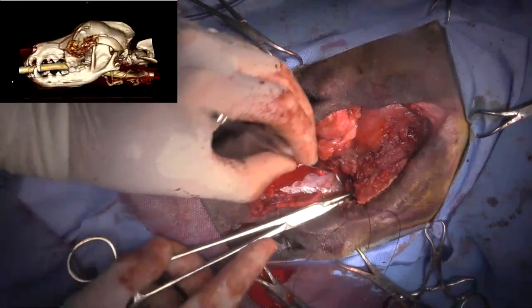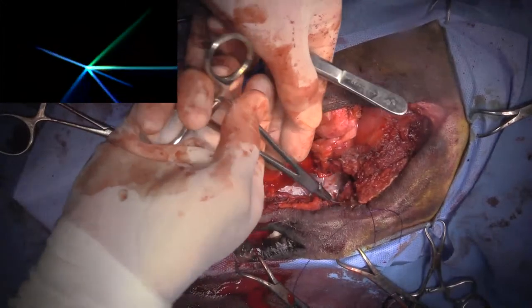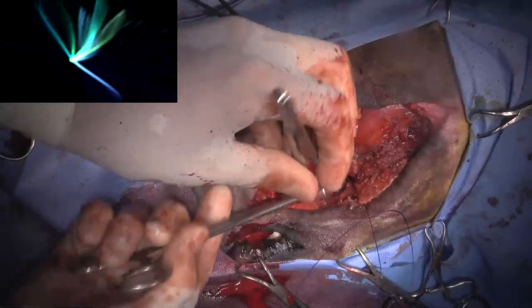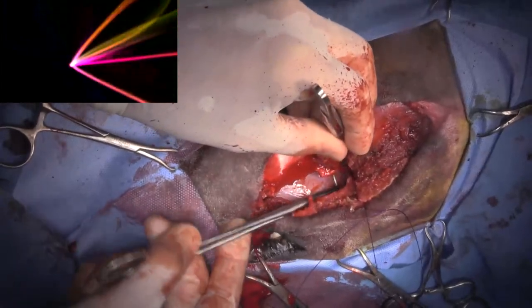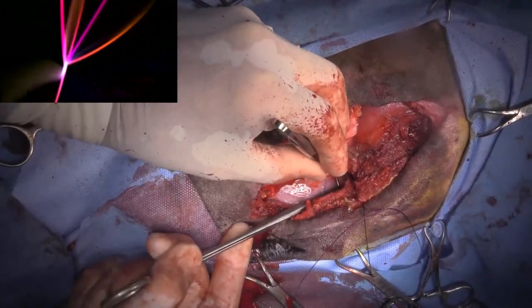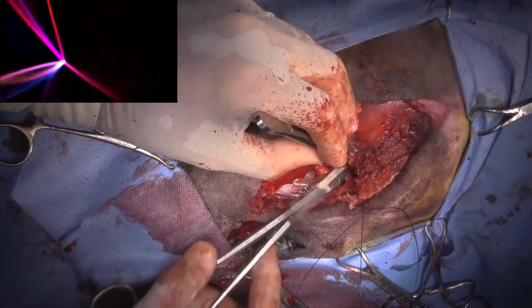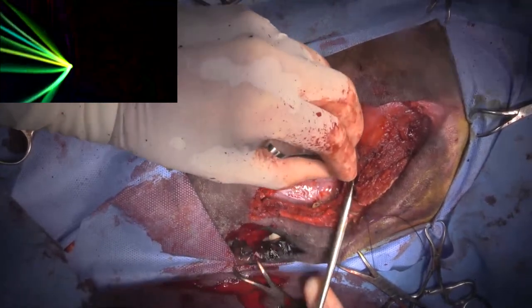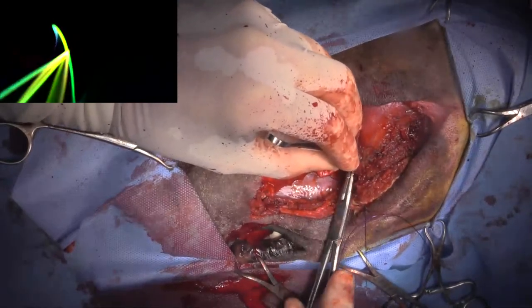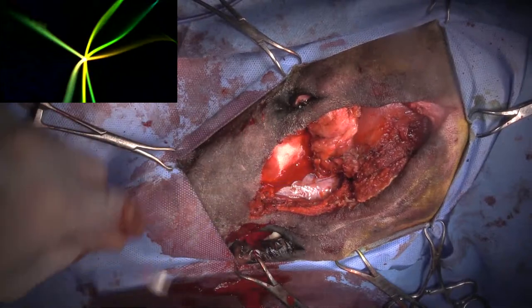As far as blood loss is concerned, how much is in the suction bucket? 275 in total. Okay. And we've got our sponges at least. Yeah, so 250 in the bucket, and then we've got probably 4 lap sponges, so that's another 200.